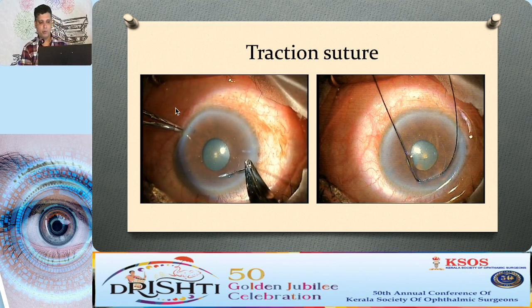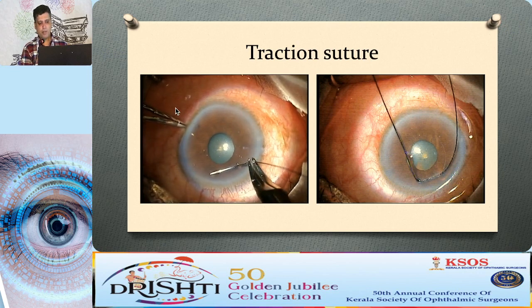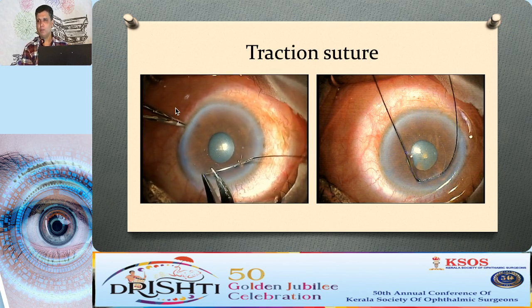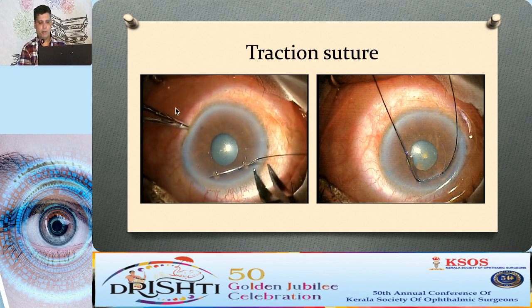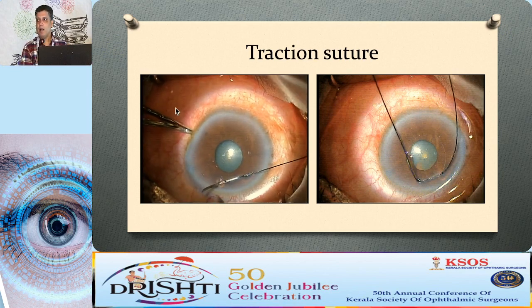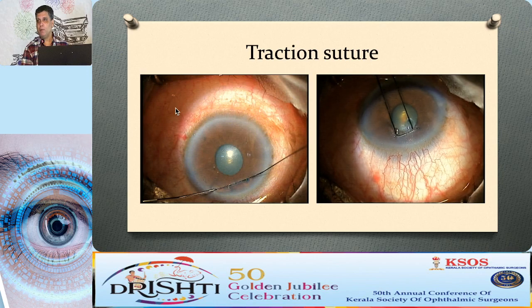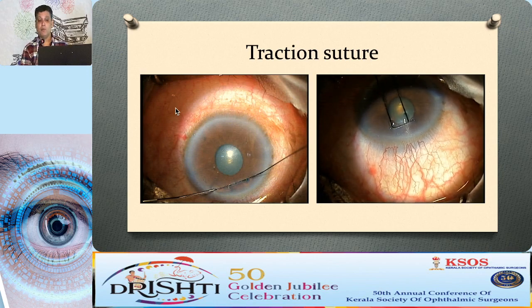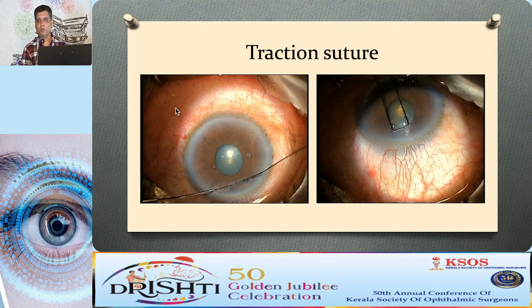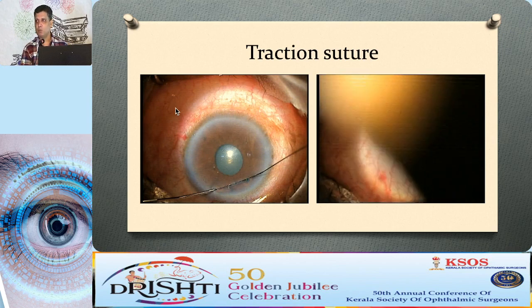It's best achieved through a corneal traction suture. With the corneal traction suture, the important thing is to get adequate depth into the cornea. If you go too deep, you can enter the chamber and deflate the chamber, after which you'll probably have to fill the chamber with the visco and then go ahead with the surgery. Or if you are too superficial in passing the suture through the cornea, when you pull the sutures towards the area opposite you want the area of exposure, it will cheese wire.